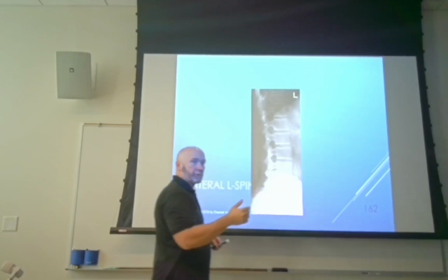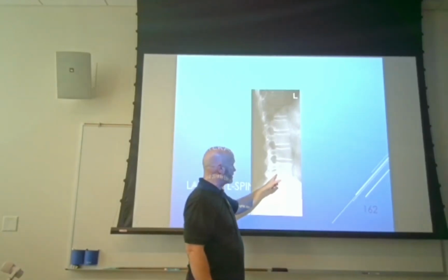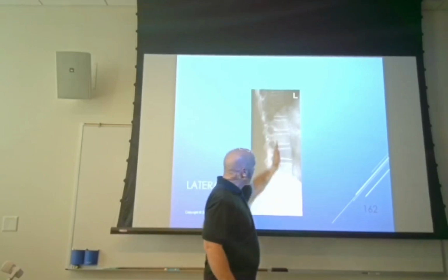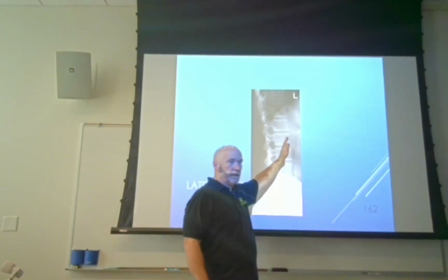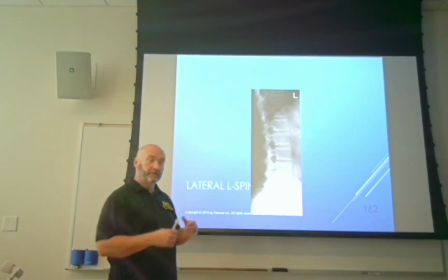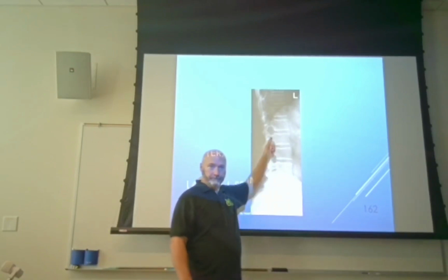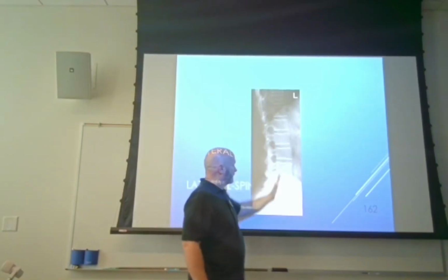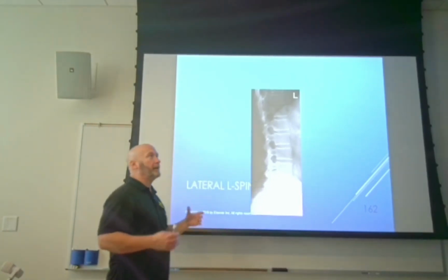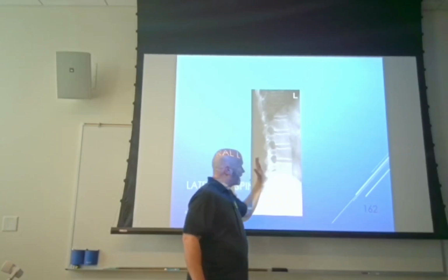If you get your patient positioned properly, you get them rolled up and their hips are on top of each other, you get them in a good lateral position, and you find the highest point of the iliac crest, and you put your long line of collimation straight up and down from that. Just pay attention to how much curvature the patient has and adjust your collimation accordingly. But that is going to be your zero and end point for exactly where to put this line of collimation. It's just a matter of getting your collimation right.